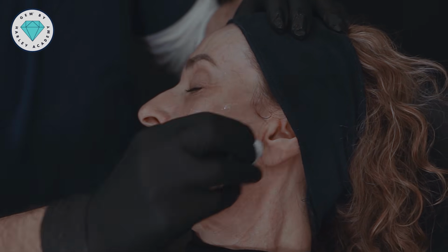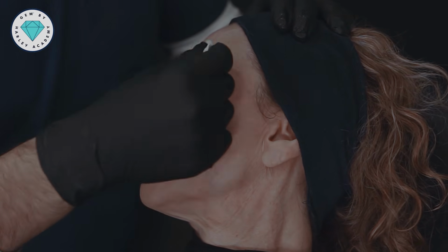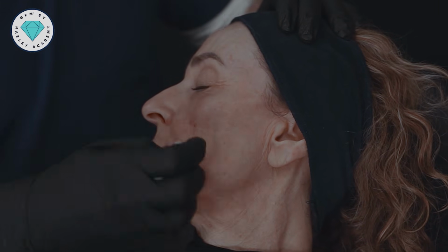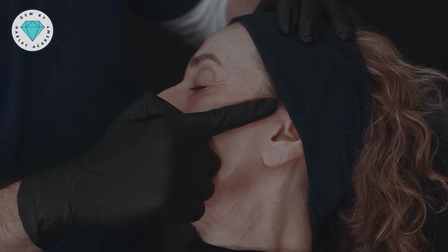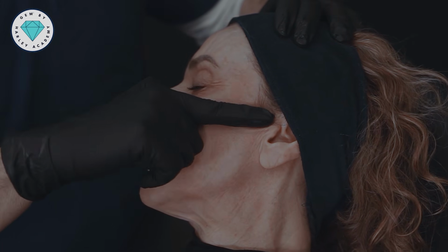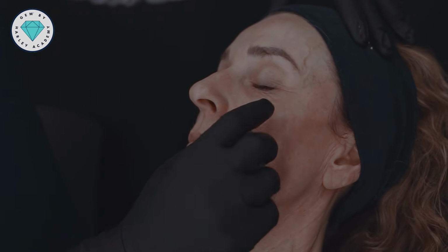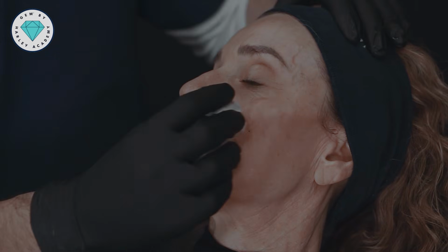Really important that we don't flatten this gel. So we've created a really nice deliberate shape now, and if I use my thumb to press, then I'm going to spoil that. So I can use my finger to roll like this, and that's going to be a nice way to create some definition. But otherwise, we have a nicely defined apex of the cheek and some lateral projection. Let's have a look if you sit forwards. So we can start to see some very nice shape on that cheekbone compared to the shape of this one. We're a little bit more angulated, a little bit more projected and defined.